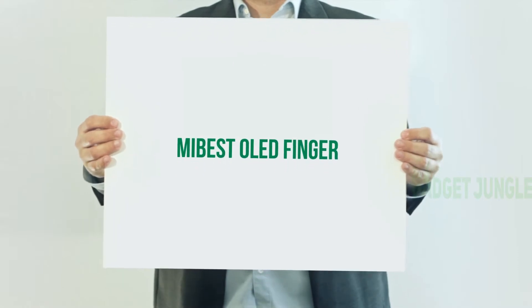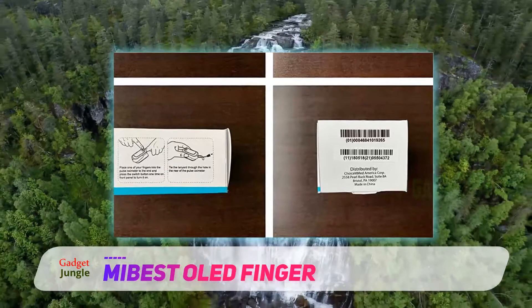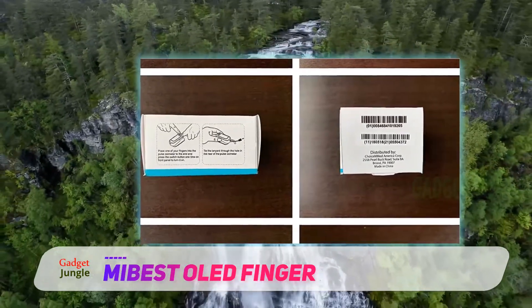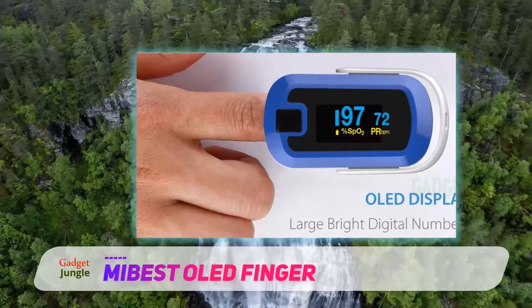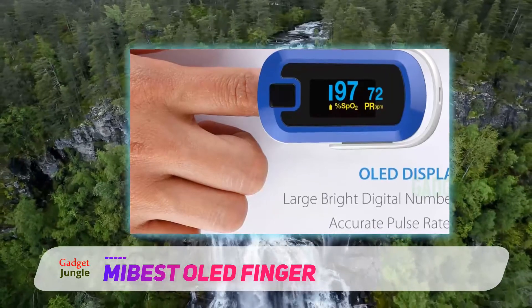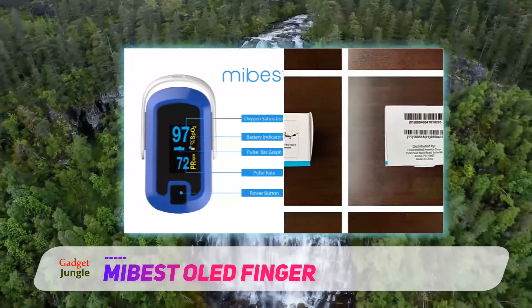The MyBistool Color Olade Finger Pulse Oximeter is an accurate pulse oximeter with a sensor that can check your blood oxygen saturation levels and pulse rate in real time through a neat pulse bar graph. It also has 6 display modes, 10 different levels of brightness, and will warn with an indicator when the pair of AAA batteries powering the device is almost empty.